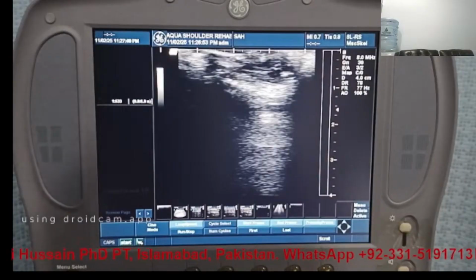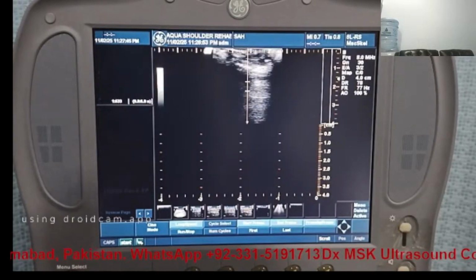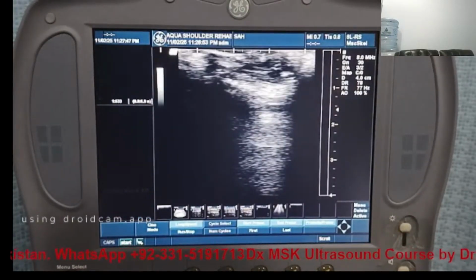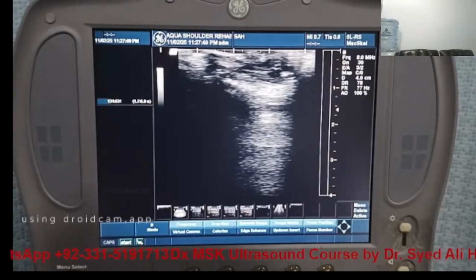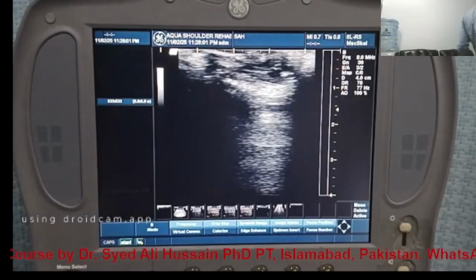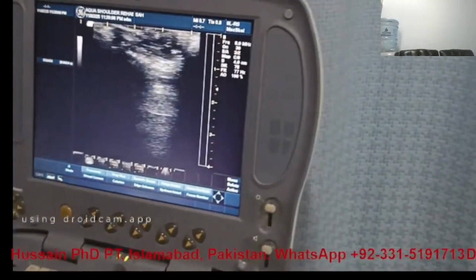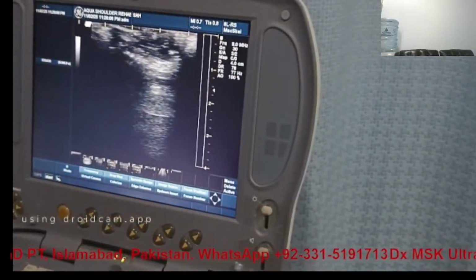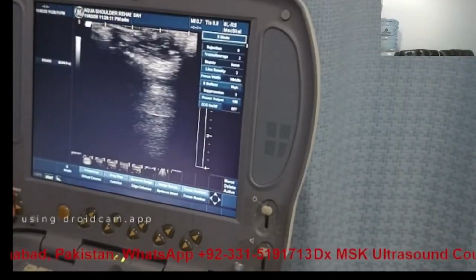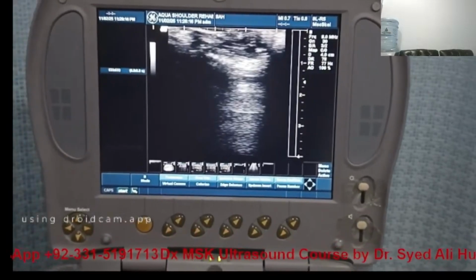Apart from that, there is one more setting. Let me see, acoustic output should be in the mode. When we select the B mode, you click onto the presets, and you can change. Let me just sit, and let me see the keys first, because I can use these keys. There were the menu select. Yeah, just give me a second. This is not good.